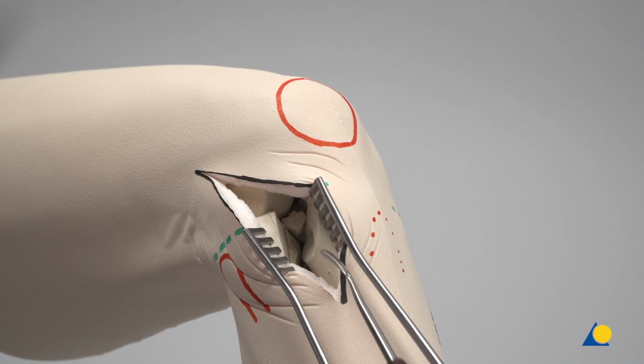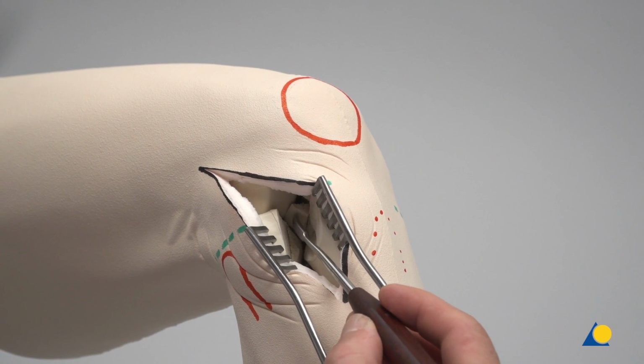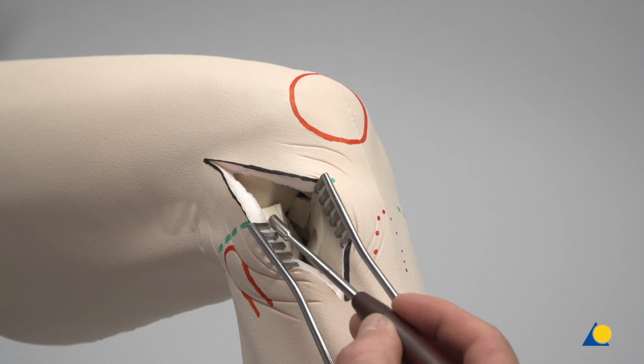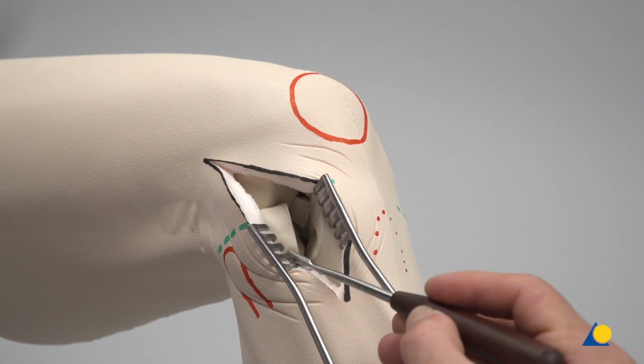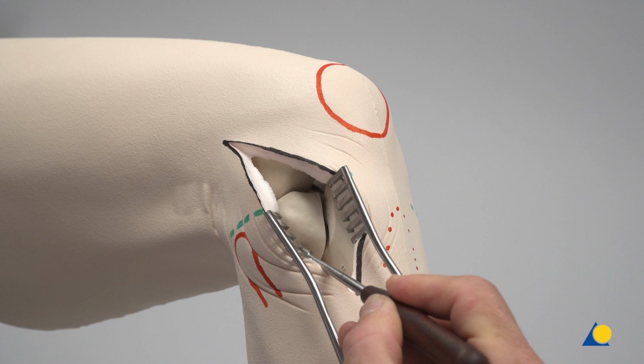The condyle is carefully opened through the anterior fracture line to fully examine the extent of damage to the lateral condyle. The intermediate fragment would then be reduced and provisionally fixed with a K-wire, the bone defect augmented, and the main lateral condyle reduced and fixed with the VA LCP Proximal Tibial Plate 3.5.